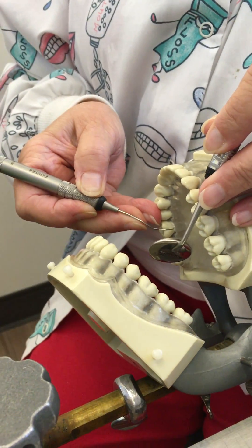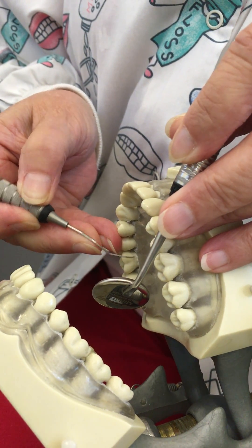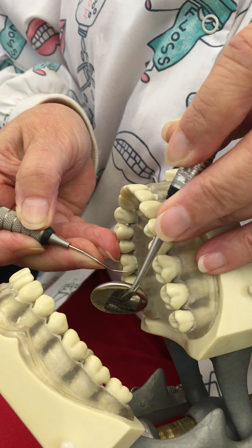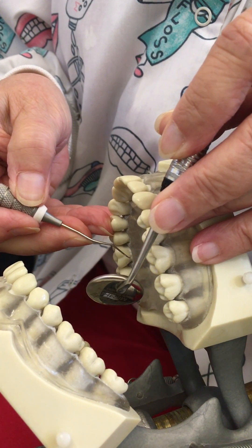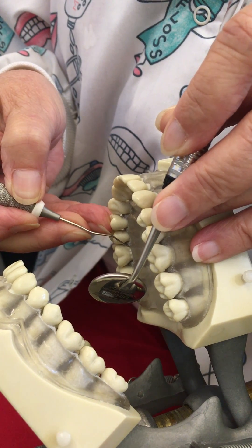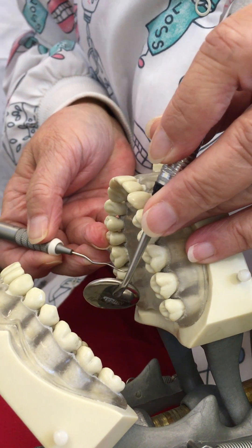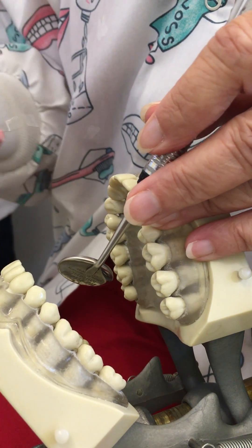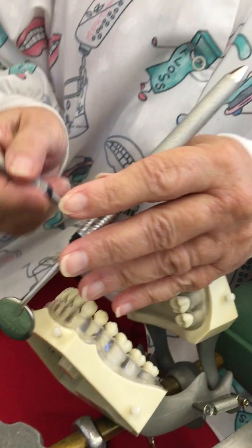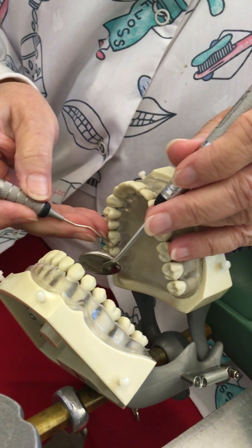Here or here — now it's parallel. But just for the sake of argument, if I do it this way, where's the handle coming out? It needs to come out this way. Remember there are cheeks here and the handle has to come out of the opening of the mouth. So again, with complete indirect vision, I'm going to establish my fulcrum on tooth number three.